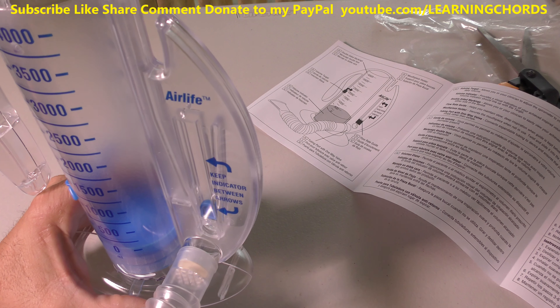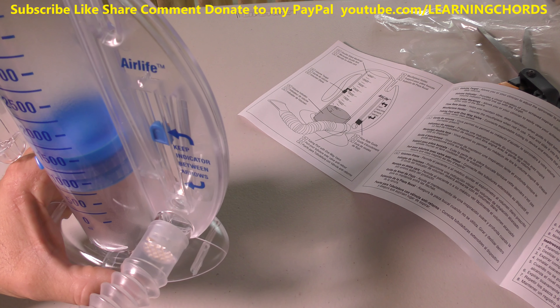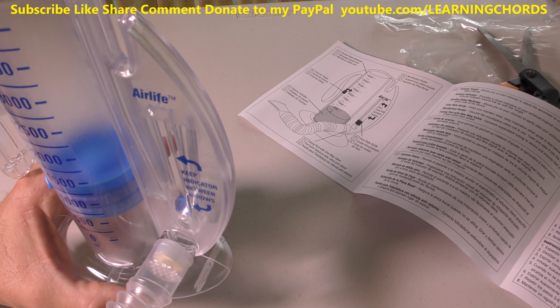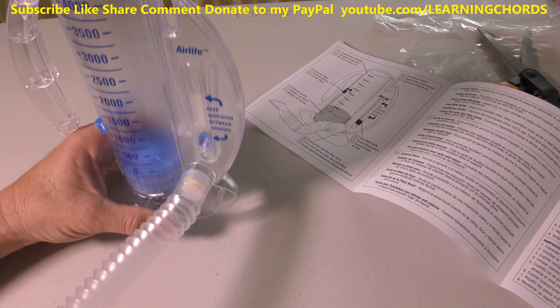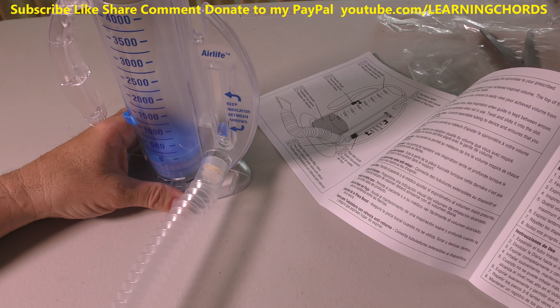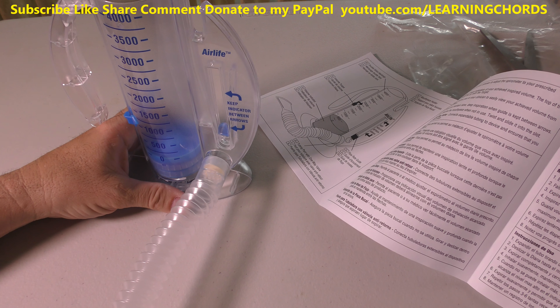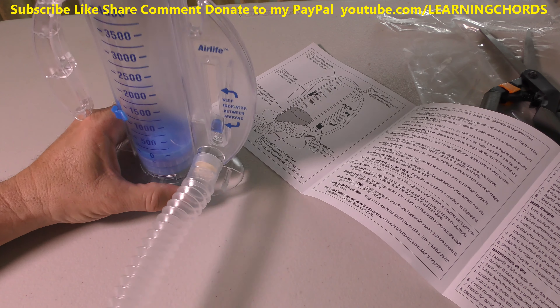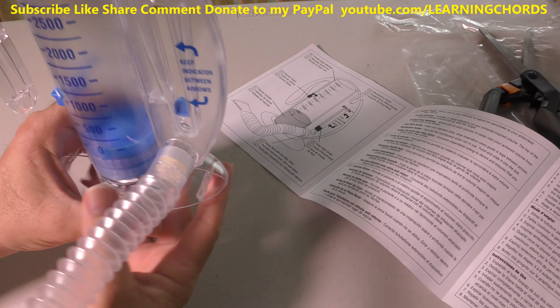I think I got up to like 3,000. So you inhale, keeping it between the guides — that's the key part — and when you can't inhale anymore, hold your breath for six seconds and note the highest reading. I think I got somewhere around 3,000.